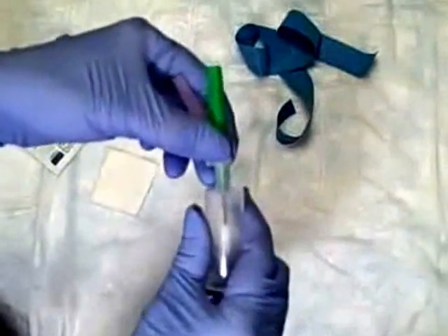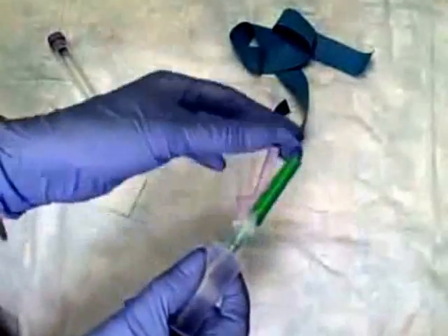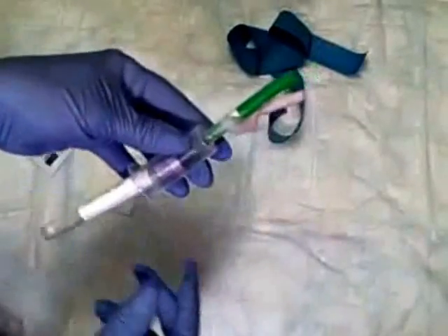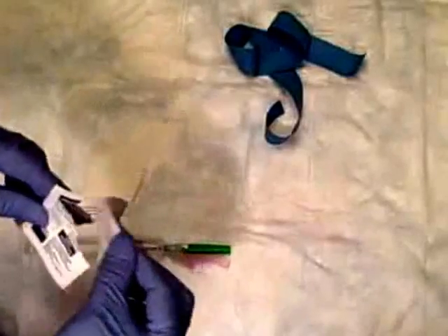We're going to attach that, and then our needle is underneath here. When we're ready to perform the procedure, we'll just remove the cap. I usually like to put the vacutainer gently inside the hub for now to keep everything ready. I'm going to open up my alcohol swab and set that aside — now I think we're ready for our patient.